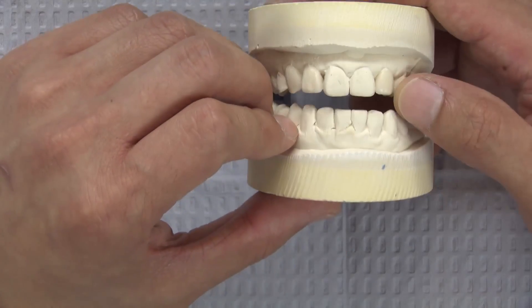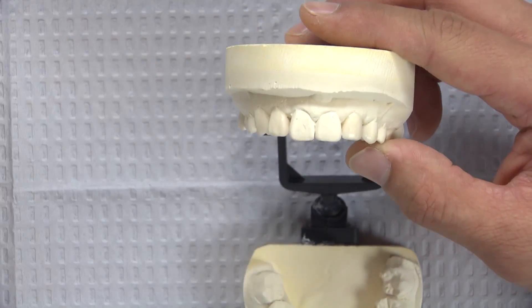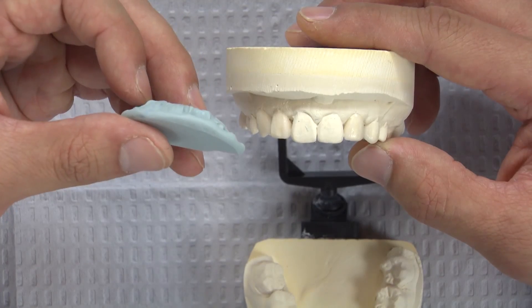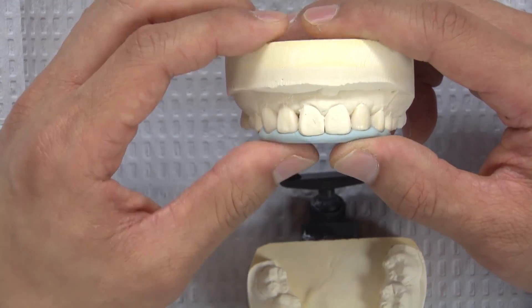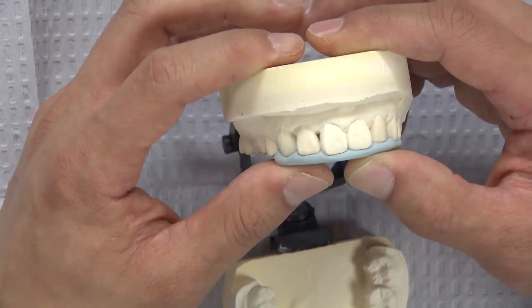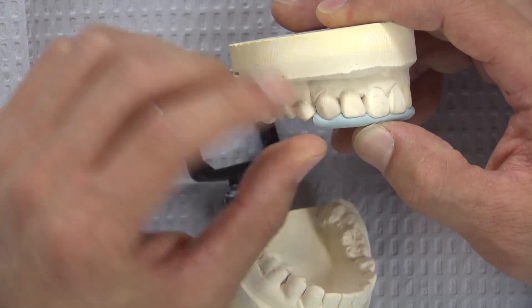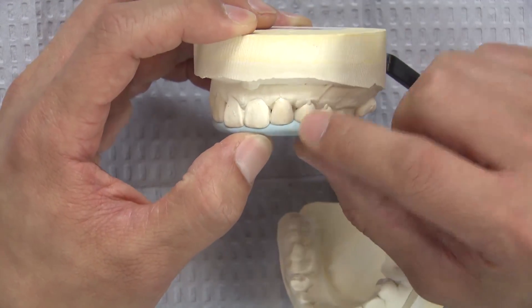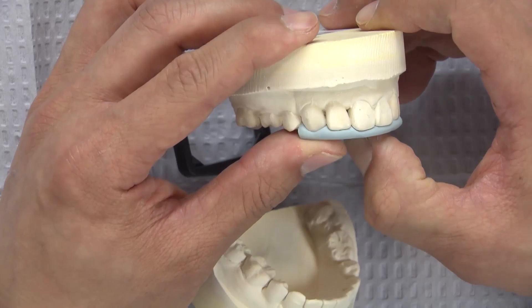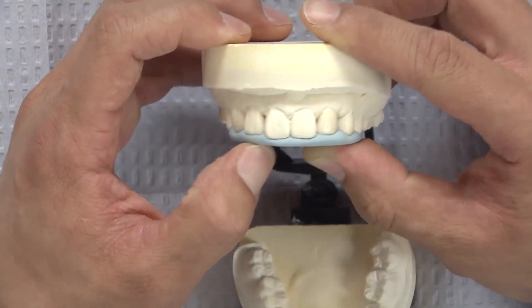From the wax-up, so I can transfer what I hope to achieve intraorally, I fabricate a putty matrix. I position it along the incisal edge, and what this allows me to see intraorally is the planned position of the incisal edges. The scalloping also helps me determine exactly where to position the interproximal areas on each tooth.